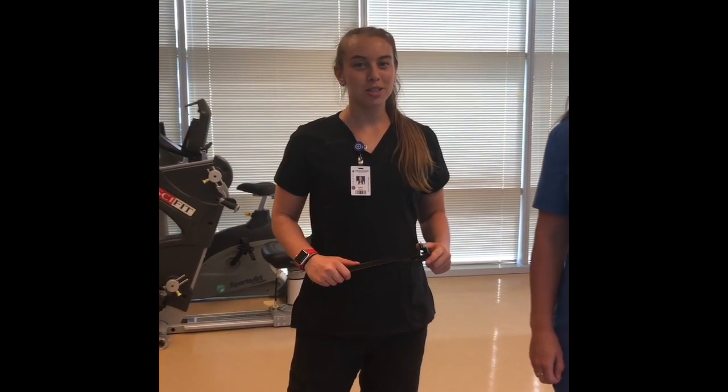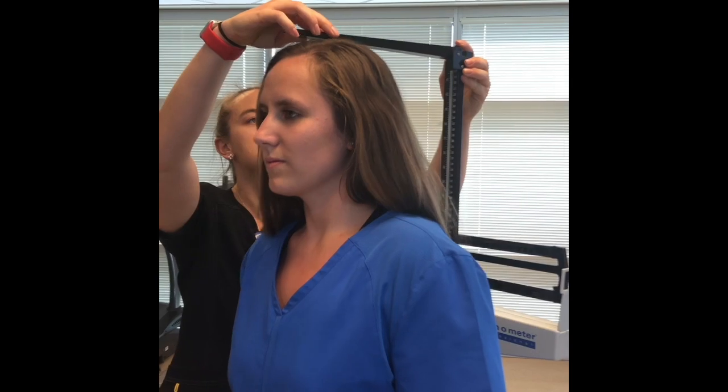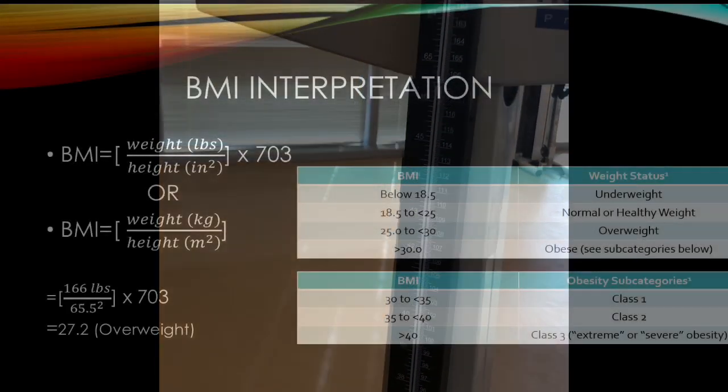Now that we can properly measure her height, you're going to have your patient take a deep breath in, and you're going to take that horizontal bar and just lower it down until it gently hits the top of the head. And then you're going to have your patient step off the scale, and she is approximately 65.5 inches.